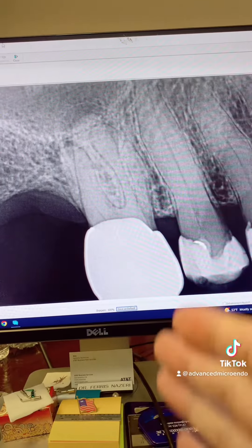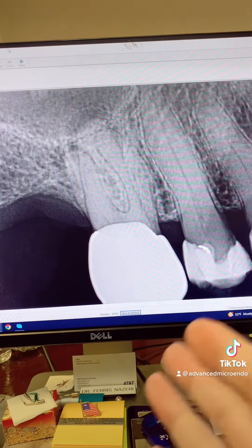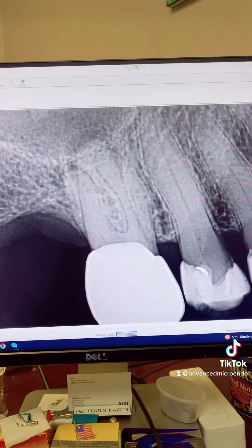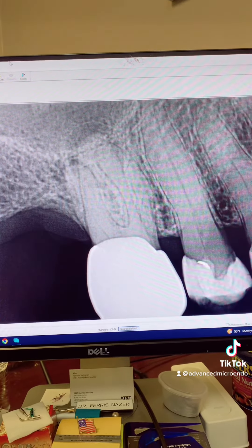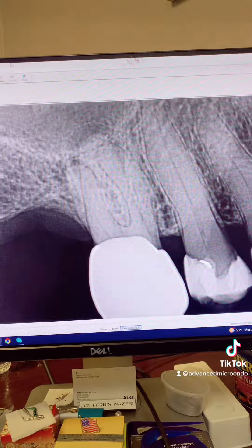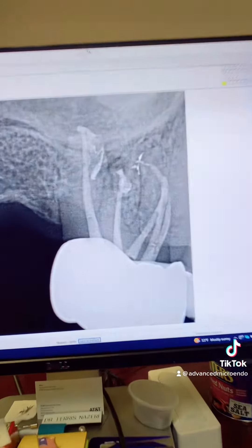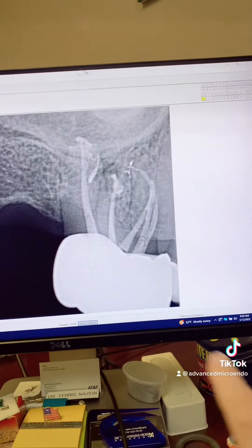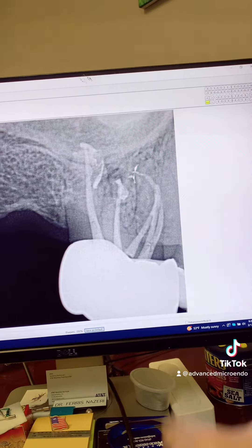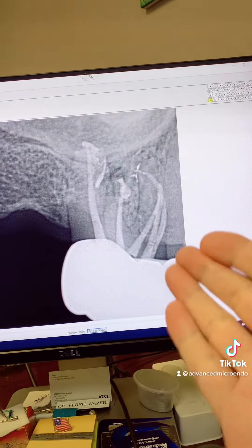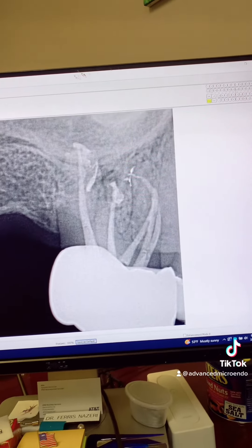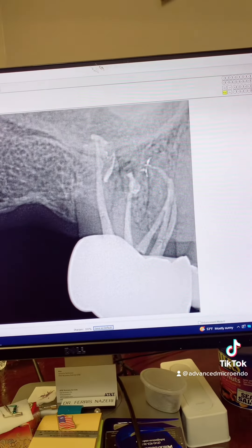So we went over options with the patient. The patient decided that he wanted to try to save the tooth. And here's the post-op — went through the porcelain crown and completed endodontic treatment in one appointment.